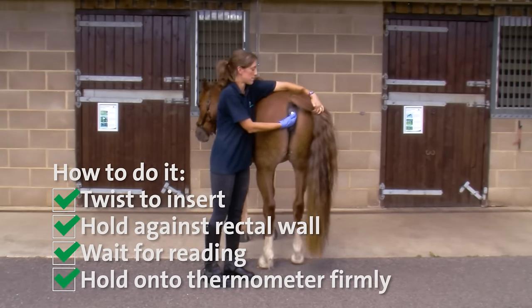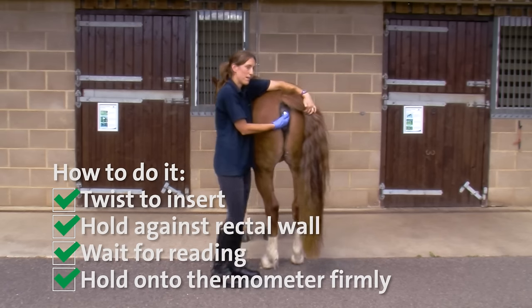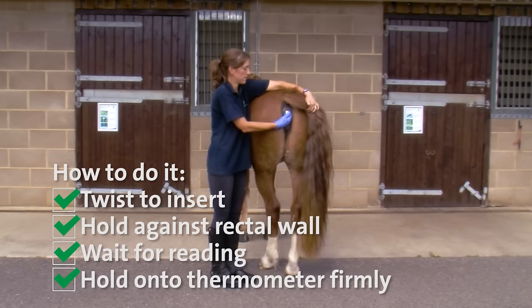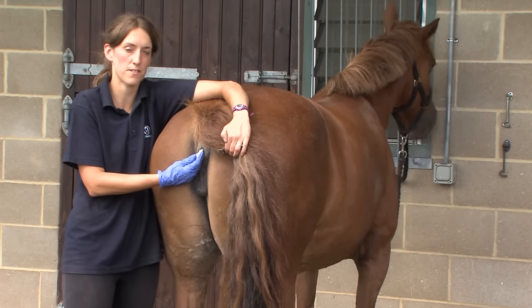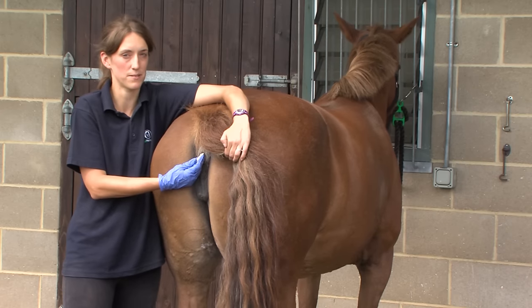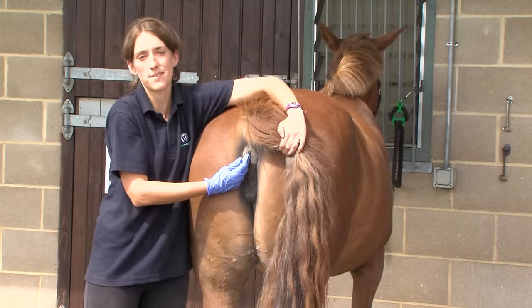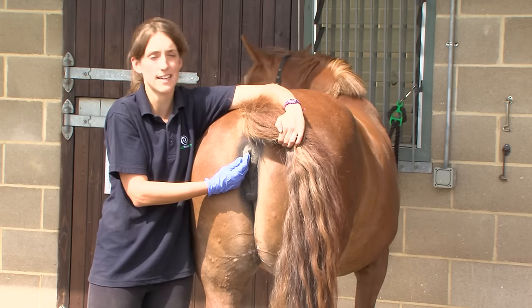With the mercury thermometer at this point you would be timing with your watch a full minute and then take your reading afterwards. It's really important to hold on to the thermometer as tightly as you can, because as Honey tightens her muscles she might end up drawing the thermometer inside her, and we really don't want this to happen — so hold on as tightly as you can.